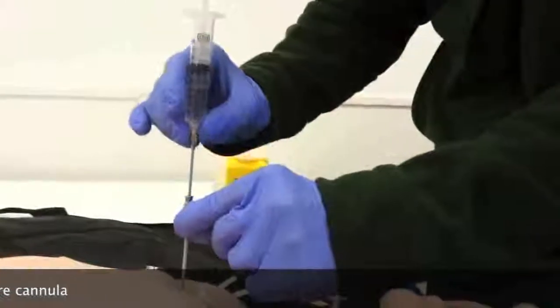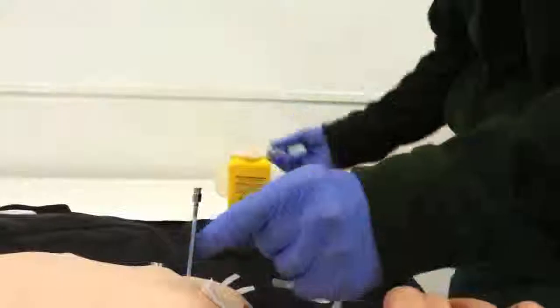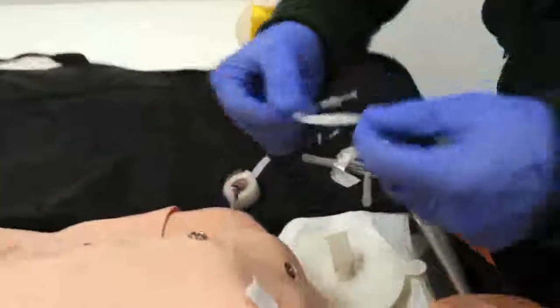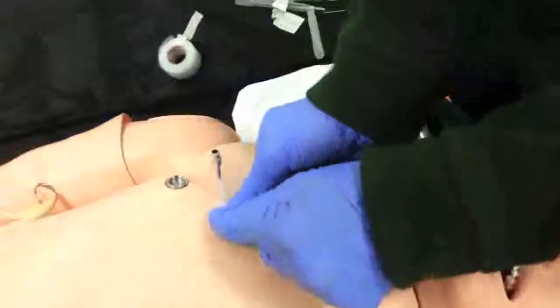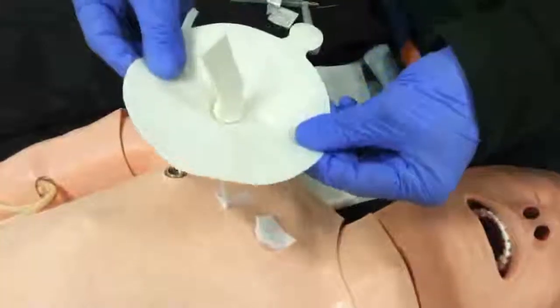Unfortunately, given the anatomy of the mannequin, I'm not going to be able to advance that any further, but what you would then do is tie that in with a little bit of tape. To do that you just wrap around there like so. And then you would pop an Asherman chest seal over the top.